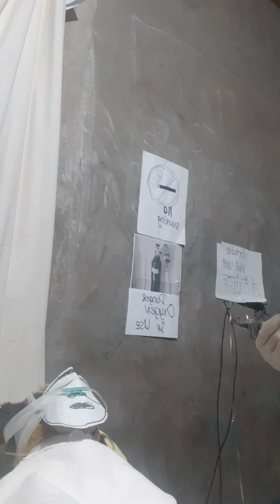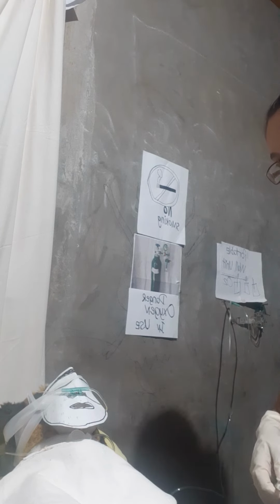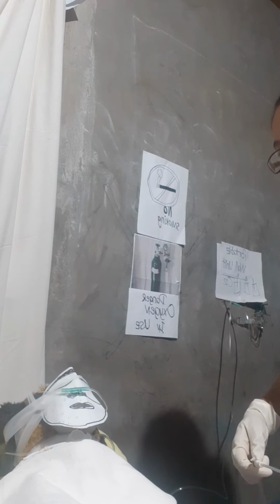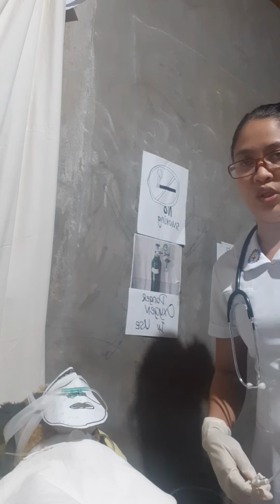First suction, then after flushing the catheter in the saline, we need to assess if it was effective and repeat as needed, according to the patient's tolerance towards the procedure.